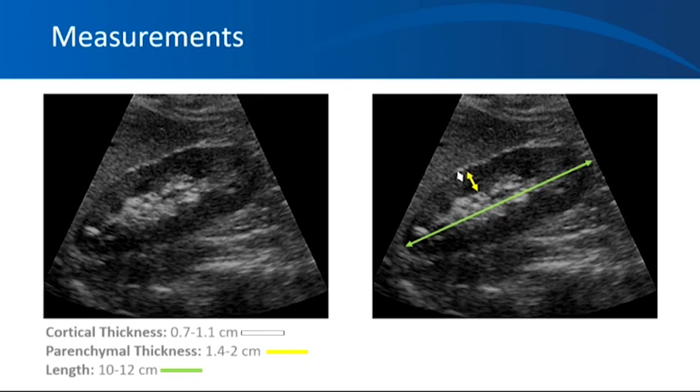Important measurements to take: when you freeze the screen in the longitudinal view of the kidney, there are three important measurements to consider. The first is the length of the kidney, which is the greatest pole-to-pole distance in the sagittal plane. It has poor precision, so this measurement should be performed several times. You must try to get the maximum length of the kidney in view — even for a six-foot-tall patient, you might measure around nine centimeters, which is probably not accurate, so you need to capture the whole kidney and its longest possible dimension.